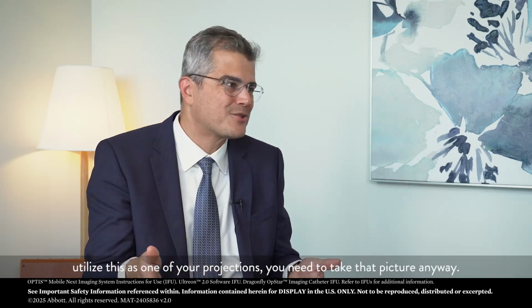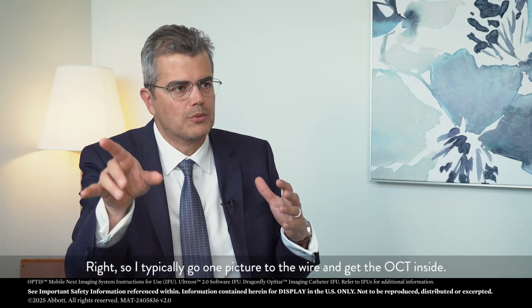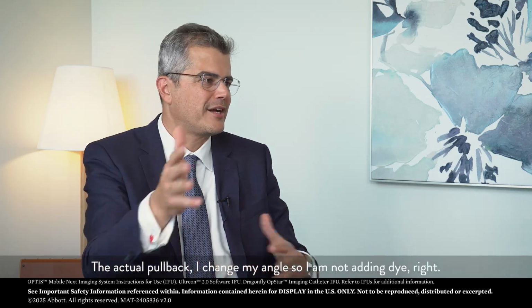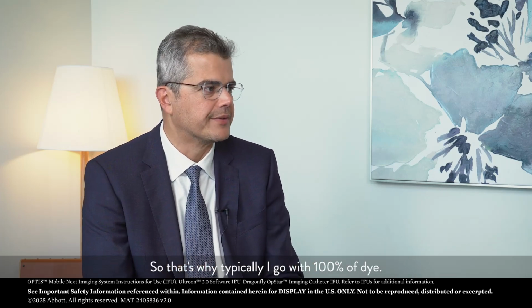You need to take that picture anyway, right? So I typically go one picture to wire and get the OCT inside. The actual pullback, I change my angle so I'm not adding dye, right? So that's what I do with 100% of dye.